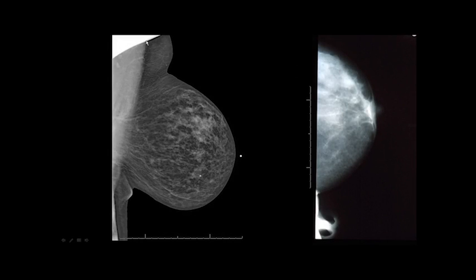Here, there's neck. There's the other breast in the way down here. This is camel nosing a little bit. If your breast goes up and then down, it's called camel nosing, to where it does truly look like a camel's nose. So you want to make sure and have this horizontal at the bottom. The nipple is in profile here.